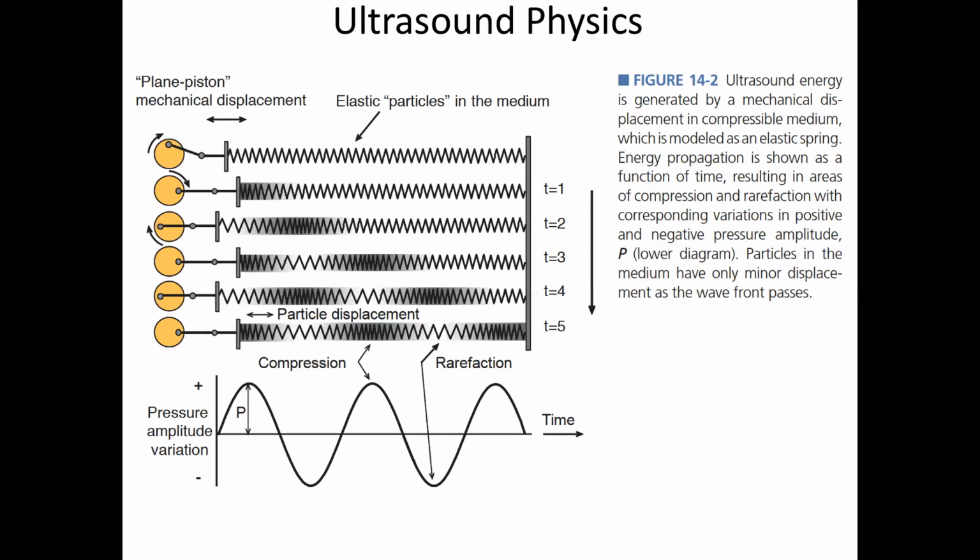And then if you go to really hard things like bone or say metal, you can do it in that too. And what happens with all those different materials is the speed of sound changes a lot, right? It's dependent on the material. And so the speed with which that wave goes through changes a lot. Also, the amplitude of this pressure decays as it's rolling through the spring, because it's heating up the spring. And so you get this depth decay.